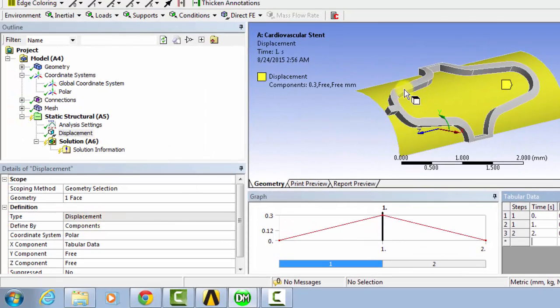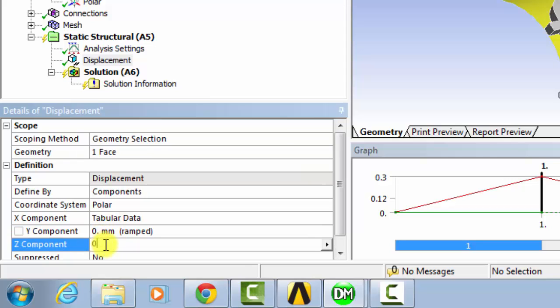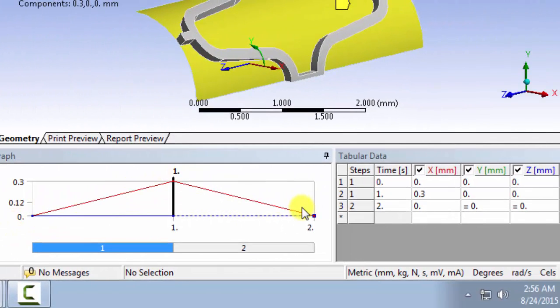Now we'll also constrain the rest of the balloon so that it doesn't move anywhere in the Z direction, and then it also doesn't rotate in the theta direction. We'll do that by setting the Y component to 0 and also the Z component to 0. So that through the whole ramping process, it doesn't move in the Z or rotate in the Y.